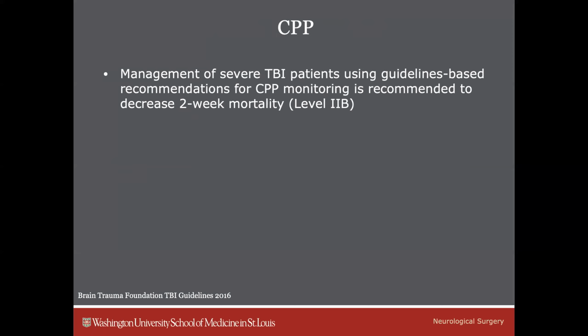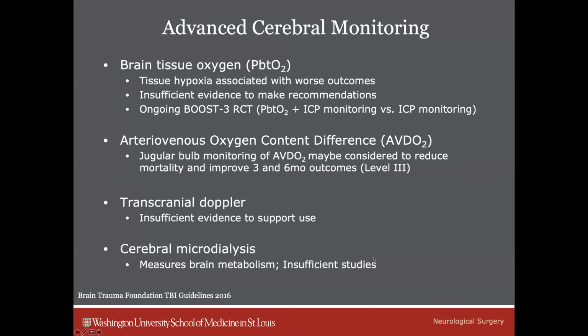So going to the concept of CPP, again, these guidelines recommend that we monitor CPP to reduce mortality in patients with TBI. So basically, a combination of ICP plus CPP. In addition to that, there's this concept of advanced cerebral monitoring that has been used to varying degrees over the last 15 years or so.